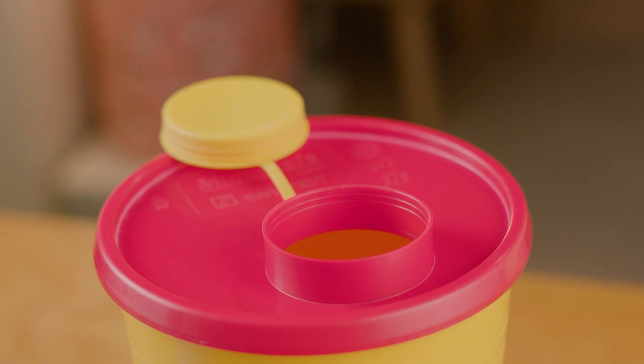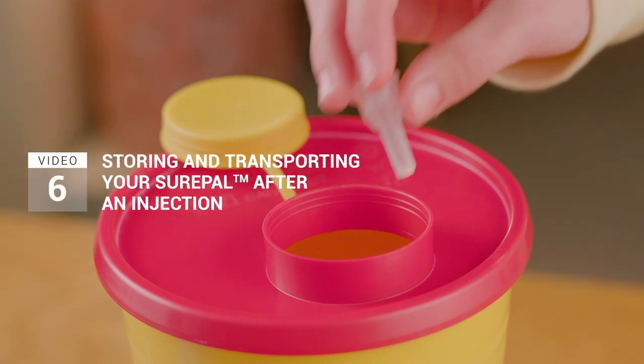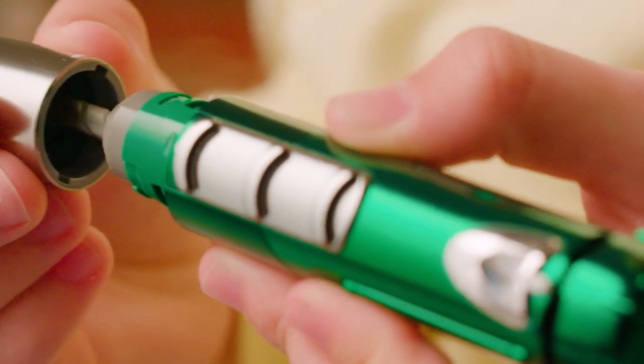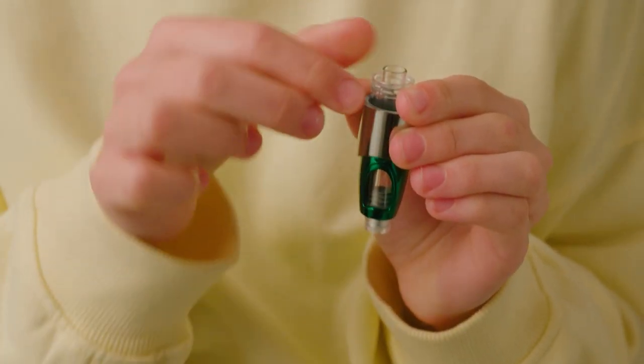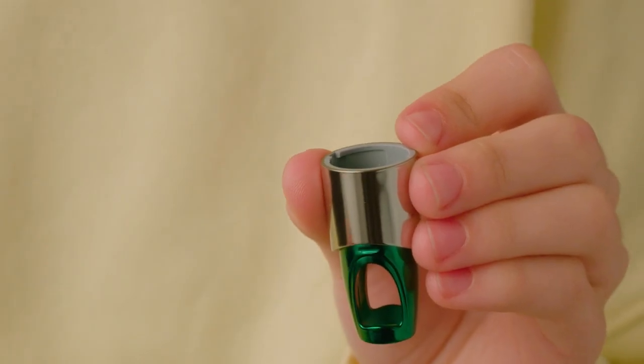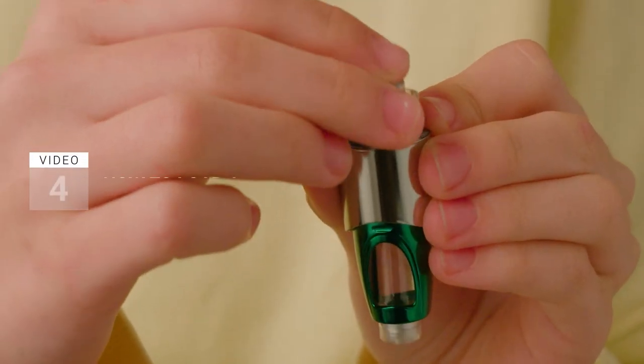When this happens, follow the instructions in video 6 to safely remove and discard the needle. Then unscrew the locking ring and push on the end of the cartridge to remove it from the locking ring. Discard the empty cartridge and put a new one into the locking ring, as described in video 4.